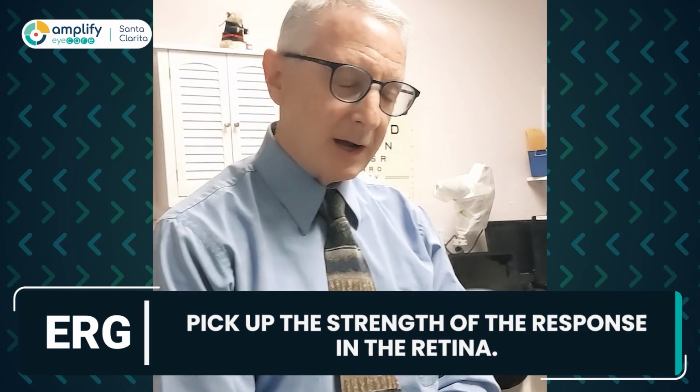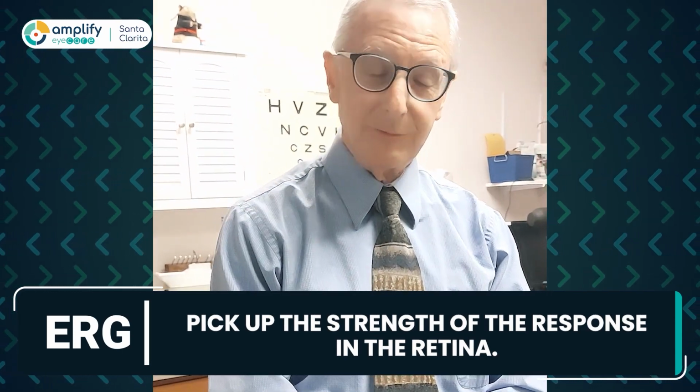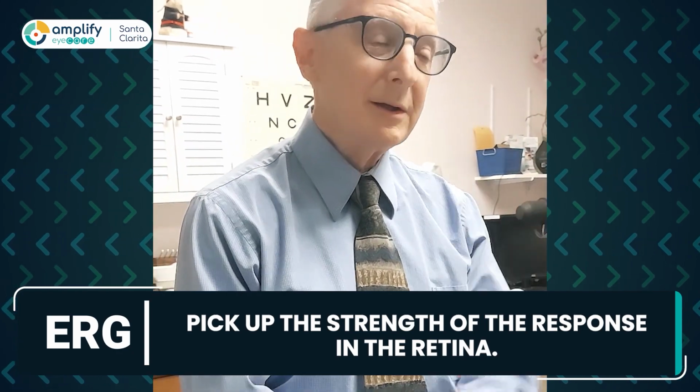Interesting. And then for somebody who has ocular diseases like diabetes or glaucoma, is the ERG portion of this used for that? Yeah. So again, now we're talking more on the retinal level. The ERG will pick up the strength of the response in the retina. So now this is retina recording of energy, how much response there is, and timing.